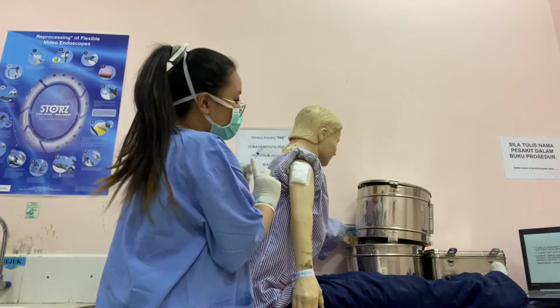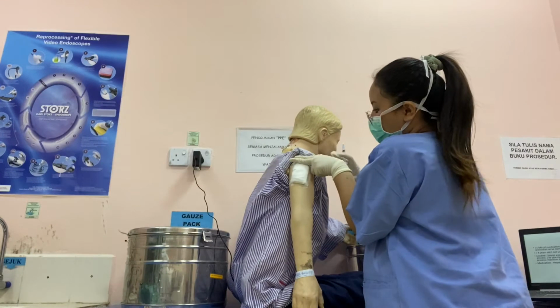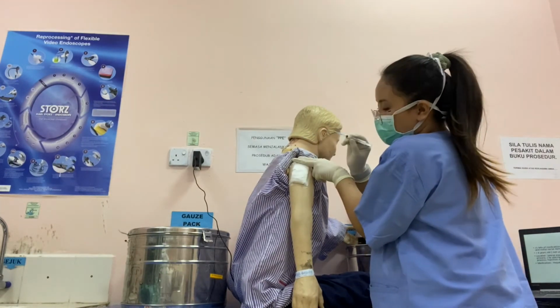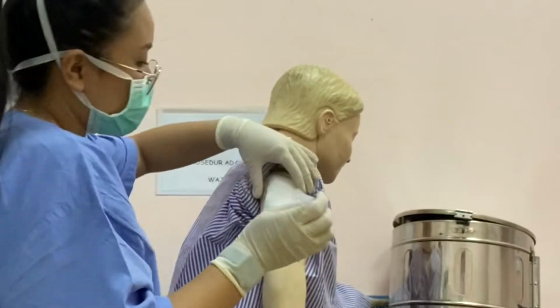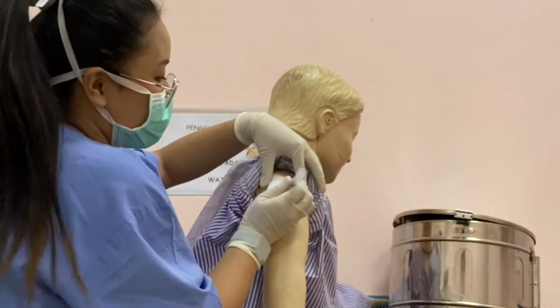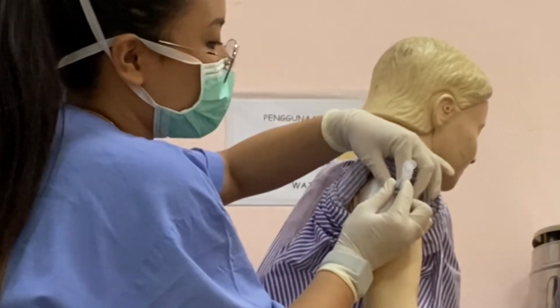Over here, right. Good. Over here, 1.5. Sorry, must be careful with your needle. 1.5. So you just poke 90 degrees on the surface. So you poke.